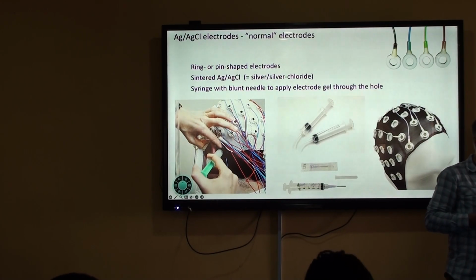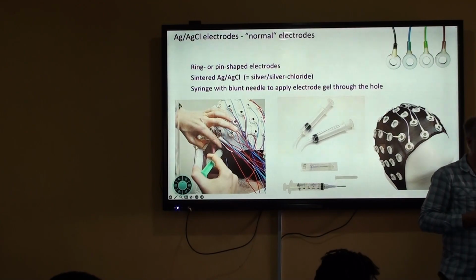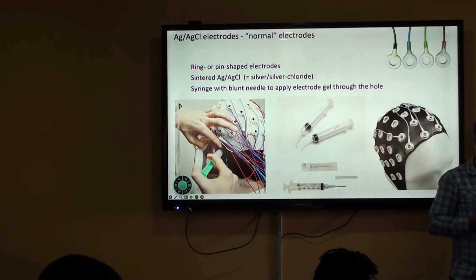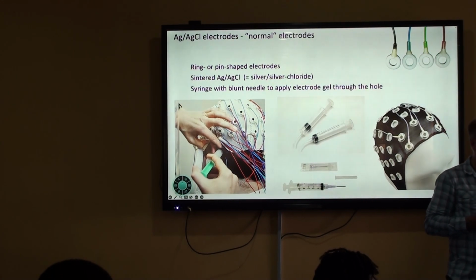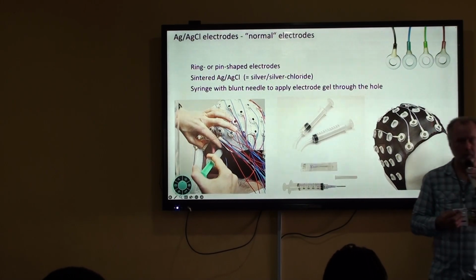I'm sorry to bring you back, but as an African research physician, it's important that we address the question. The second part of my question had to do with the design of the caps, particularly the cap electrodes. Are they based on parameters from Caucasian studies? Have you taken African studies of craniofacial parameters into consideration?